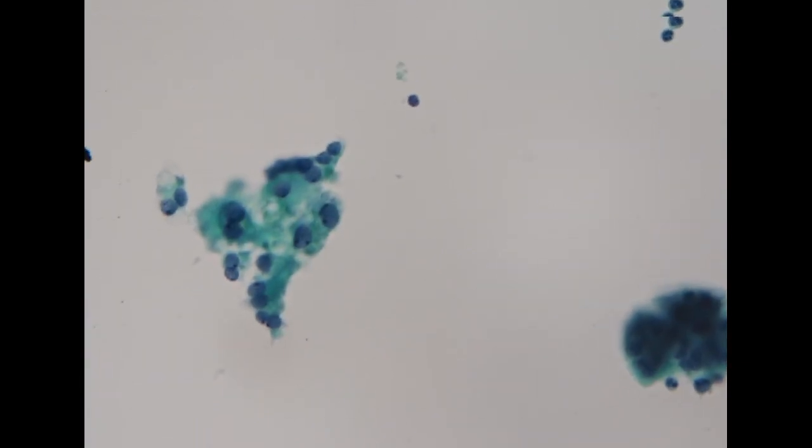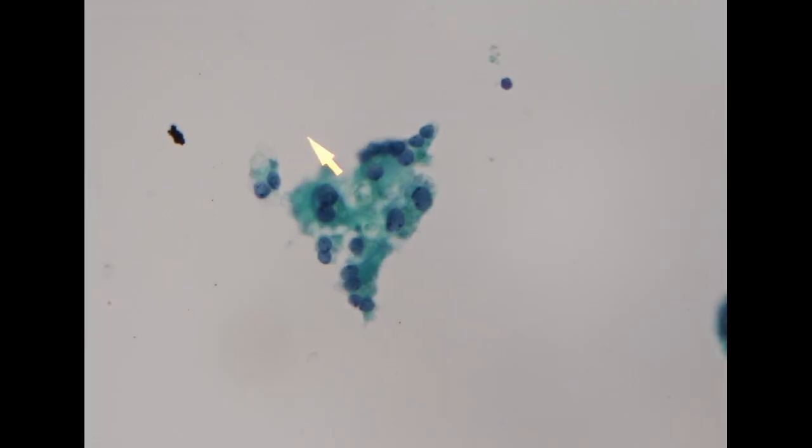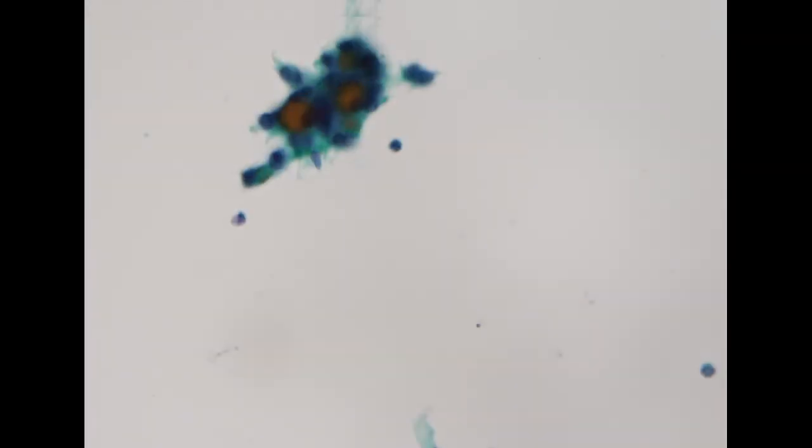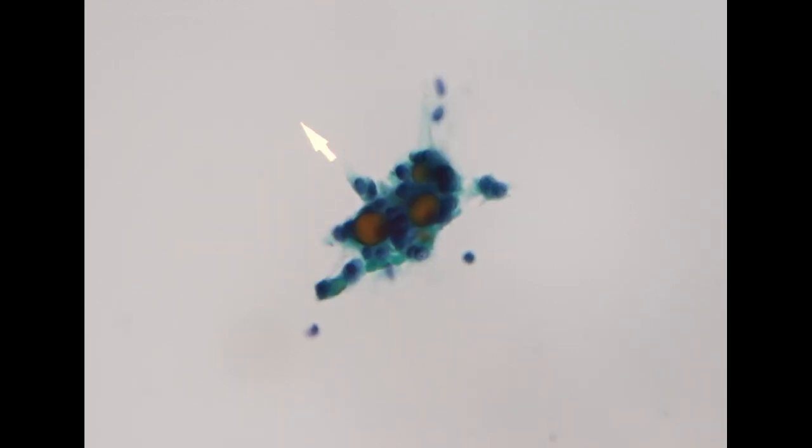For this case, I would say it does show some degree of nuclear atypia, but you can appreciate we do see bigger cells and smaller cells. Smaller cells are mostly rounded. Bigger cells sometimes show a little elongation. The chromatin pattern is a little pale, almost like a ground glass pattern. But it does form these microfollicular architectures. And in some areas we see very dense colloid, such as this one, within the microfollicle, which is also typical for follicular neoplasm.